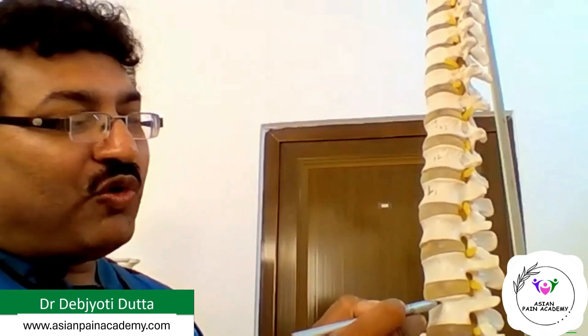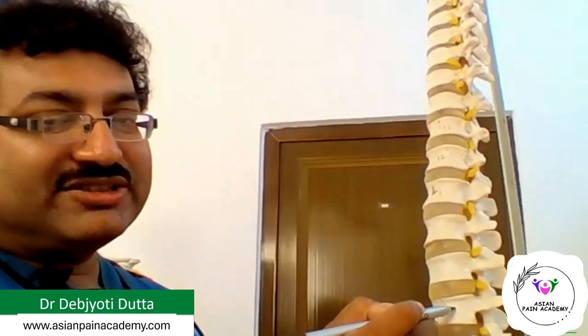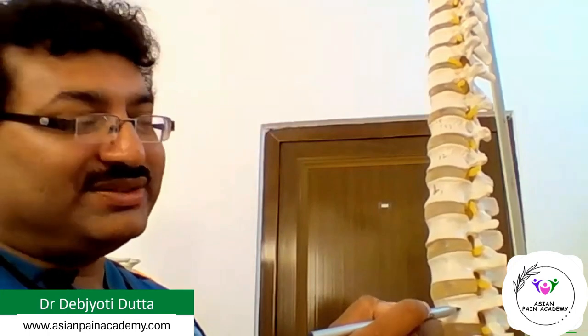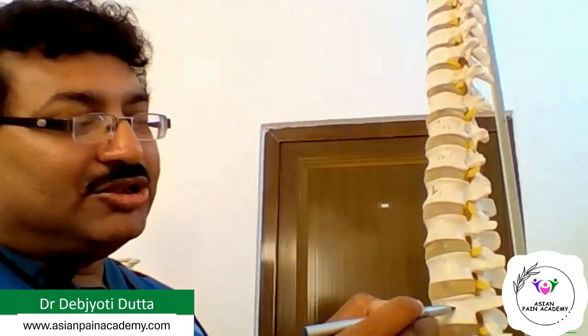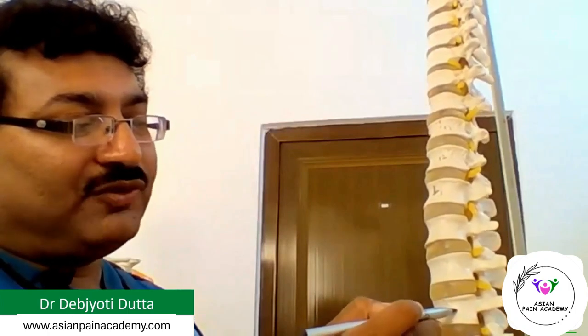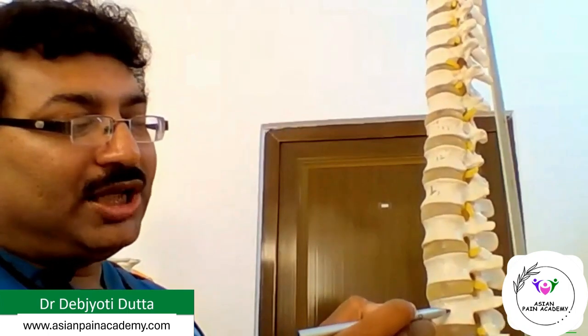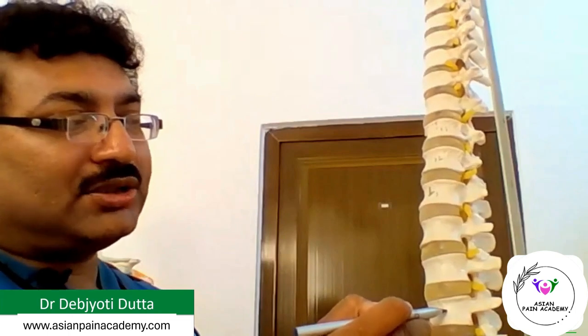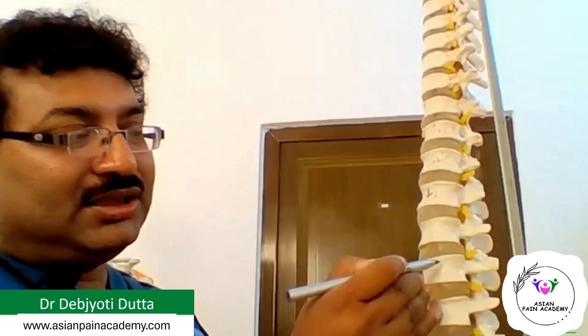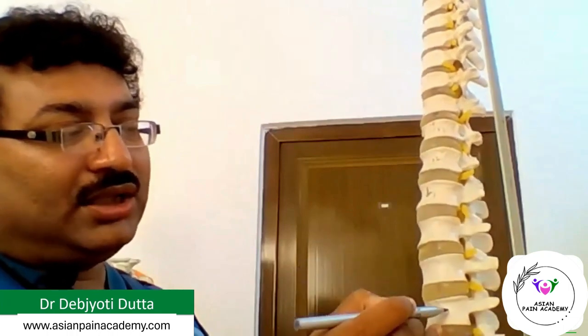The L4 sympathetic chain is most unreliable. That means the position is not always the same, but it is usually located at the middle, between the upper half and lower half of the vertebral body, and again in the anterolateral corner. So we need to reach these areas, one here, one here, one here.